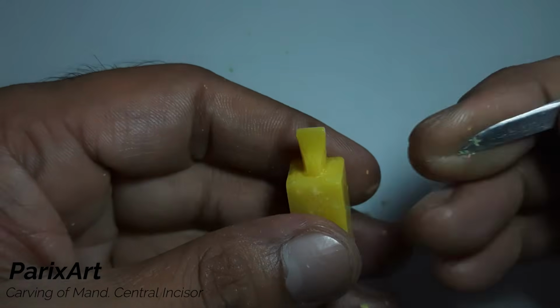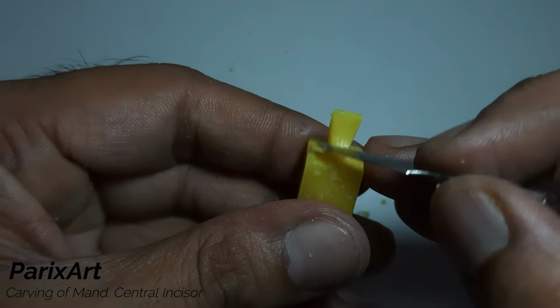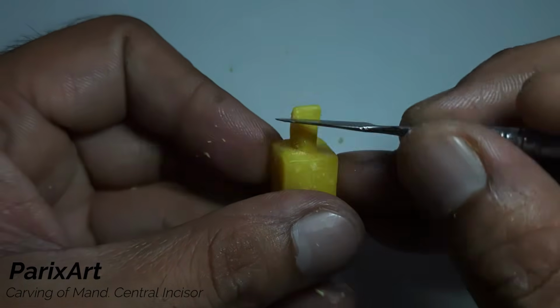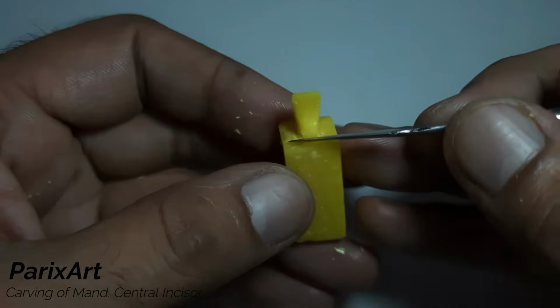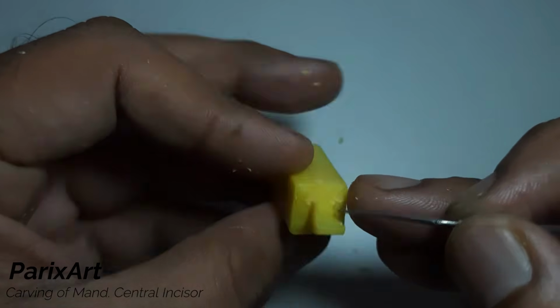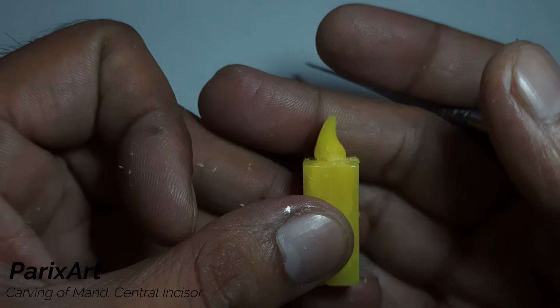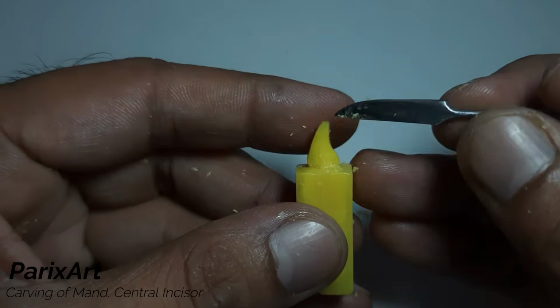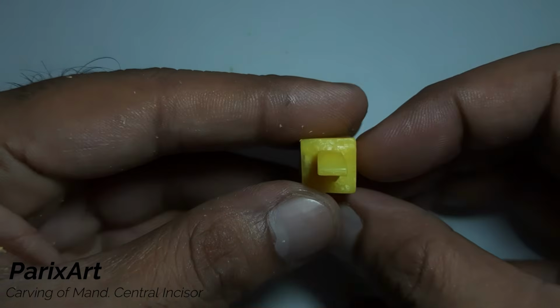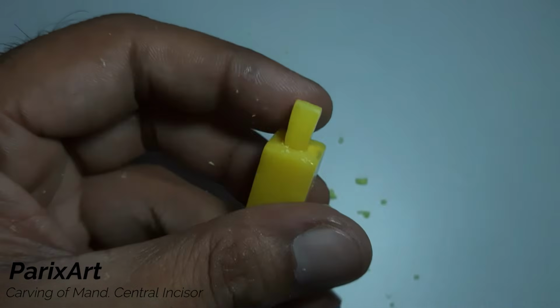Now we'll round off all the lingual line angles. Keep in mind the lingual outline too. We just need to round off the line angles.